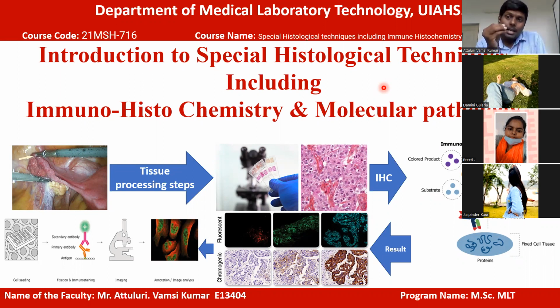How can I measure the rate of enzymatic activity in that particular tissue? How to measure the functional status of the enzyme in that particular heart tissue? That question immunohistochemistry cannot answer.